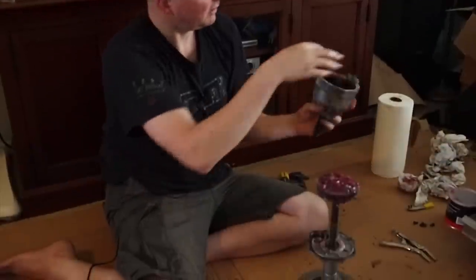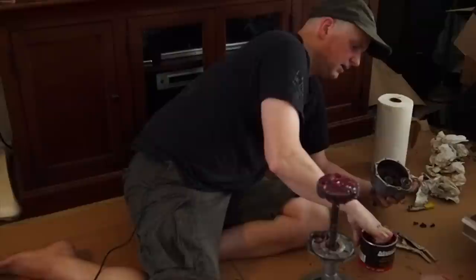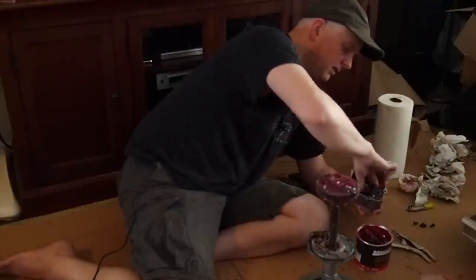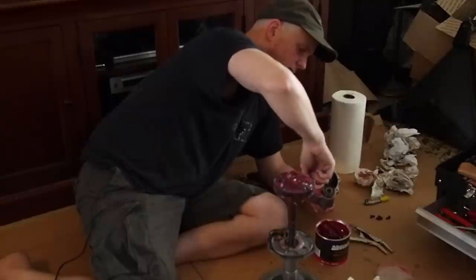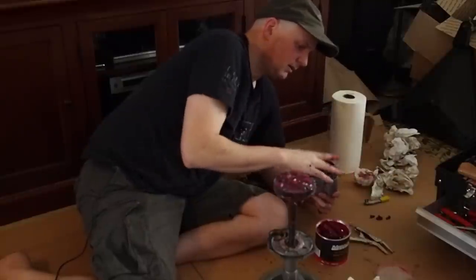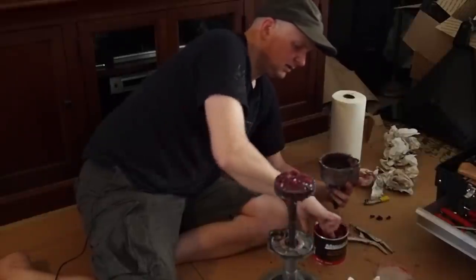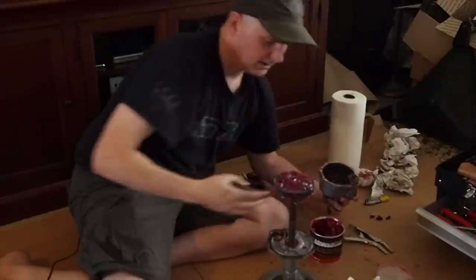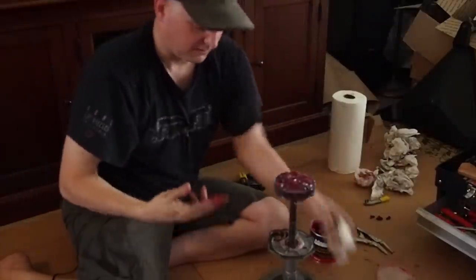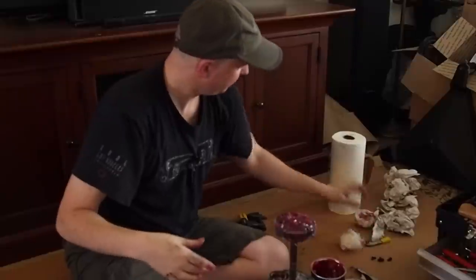Also this worm drive gear, I do want to get some grease on that too, in around that cavity in there. I'm just going to jam it in there. Just get it everywhere. I'll put some on the teeth of this gear. Okay. All right, so now I'm ready to reassemble this thing and put it back on the scooter.